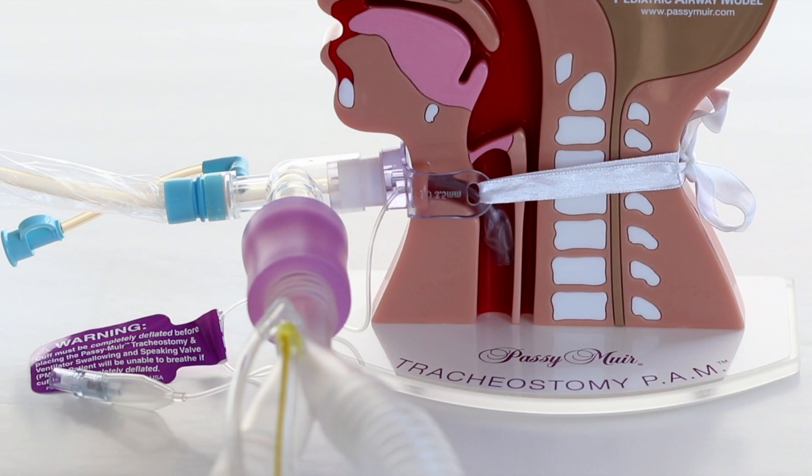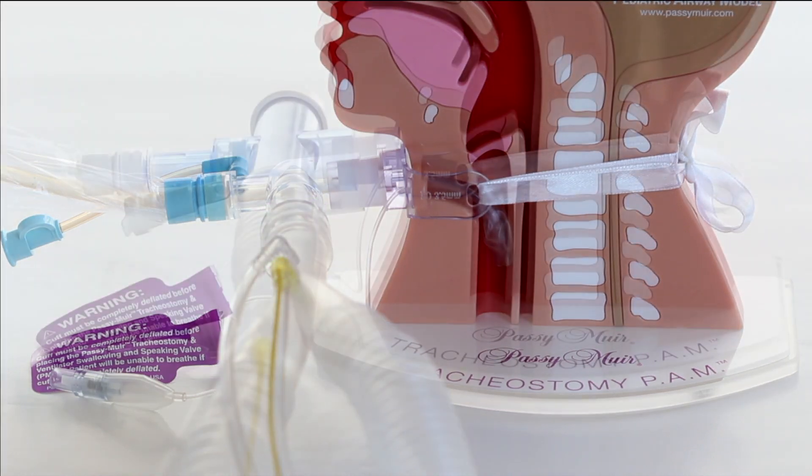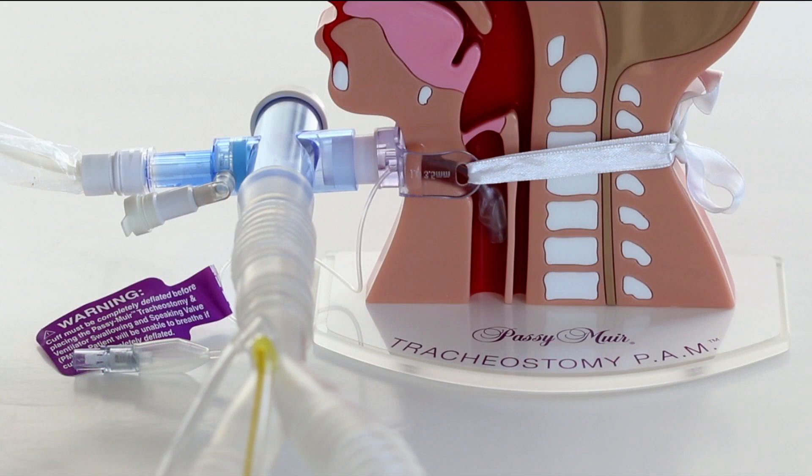The most common ways to connect the PMV into ventilator tubing are by using an elbow type or a T-piece type in-line suction catheter. Passy Muir has manufactured adapters that can be used to connect the most commonly used in-line suction catheters to the PMV for ventilator application.